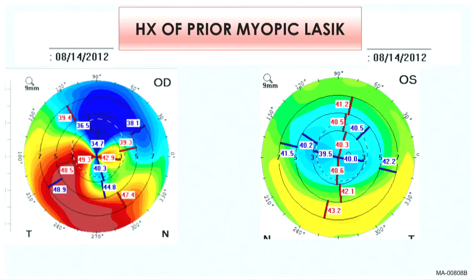Now, how about patients that have had previous myopic LASIK? Here's a patient. Dr. Rajpal, can you help me diagnose this patient? Do you think the scan on your left, how do you diagnose this patient? They've had previous myopic LASIK. Yeah, I think you're right.